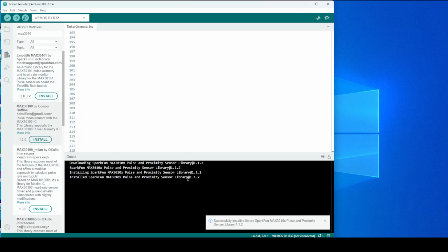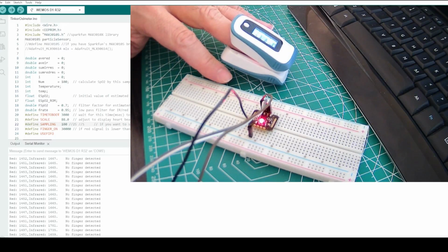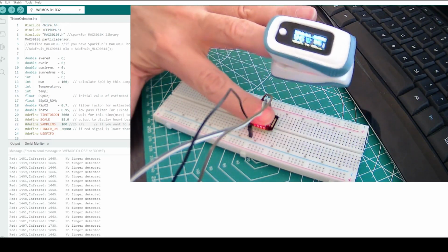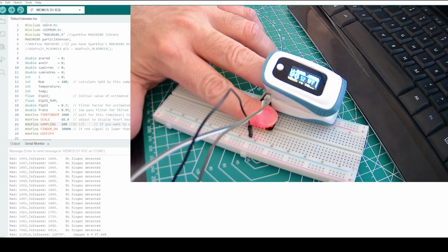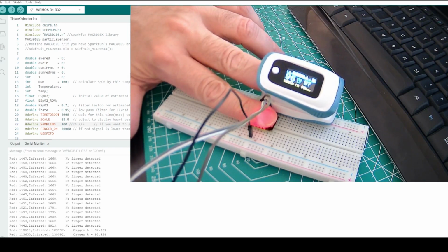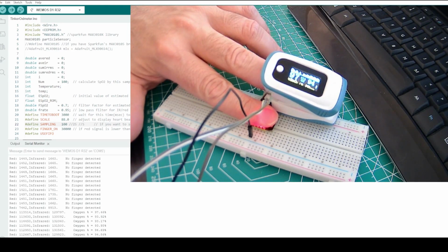Now I will show you the connected board in action. I've clamped a commercial pulse oximeter to one of my fingers for reference values, and I place my index finger on the MAX30102 device and patiently wait for the readings to settle. You can see the serial monitor output printing the results from the ESP32 board. Once you study the code, you'll see that there's a low-pass filter being used on the data. That's why it takes some time for the reported values to settle.